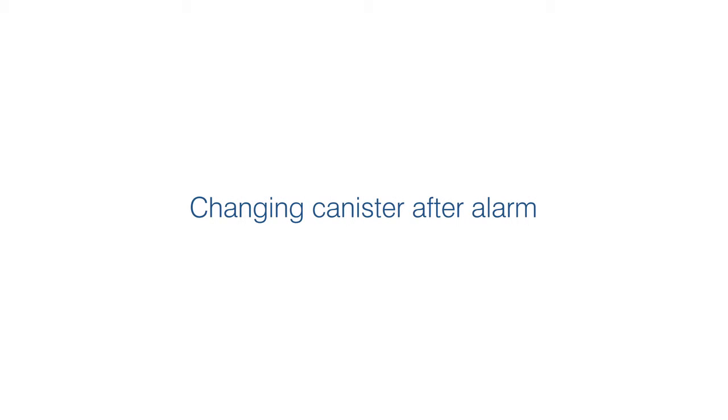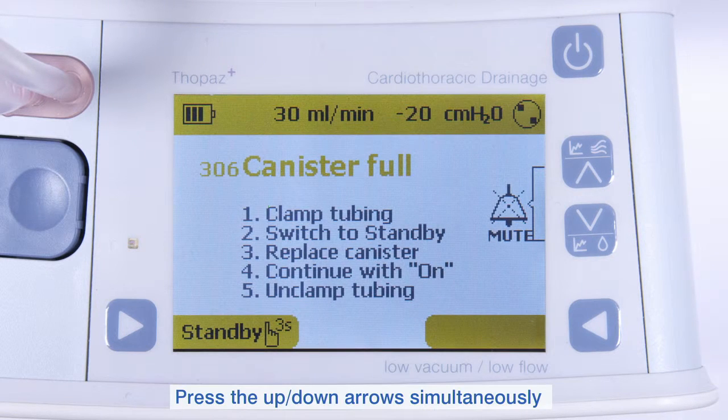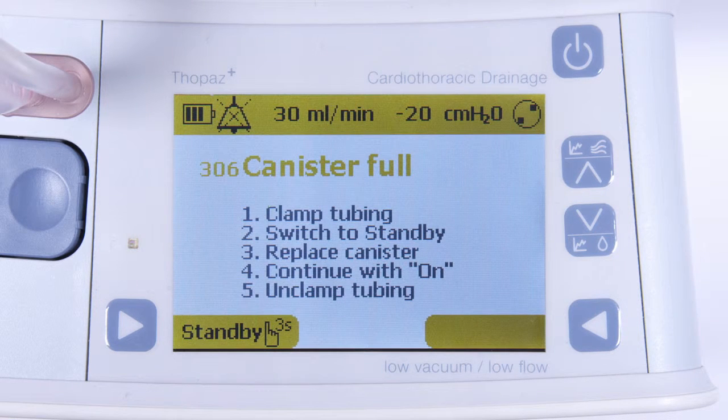Changing canister after alarm. To silence the alarm, press the up-down arrows simultaneously. Topaz Plus will now provide instructions on screen in order to resolve the problem.